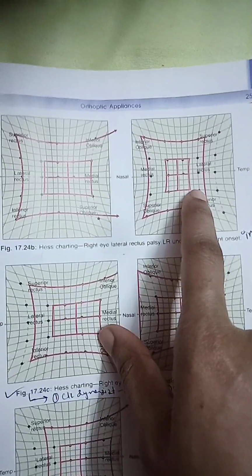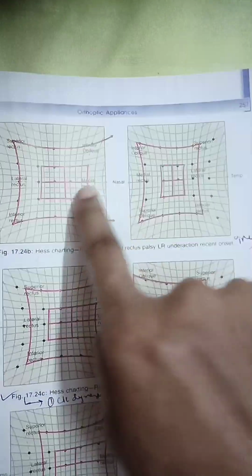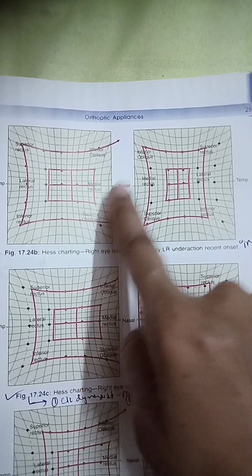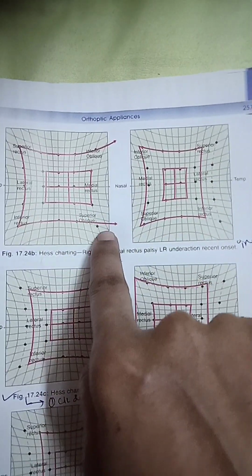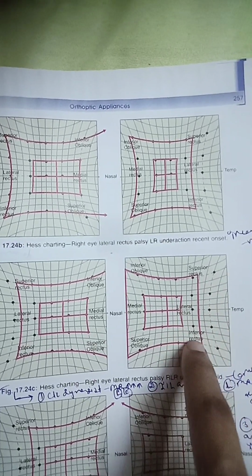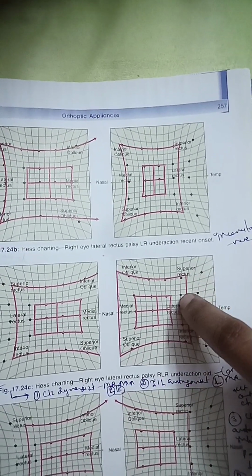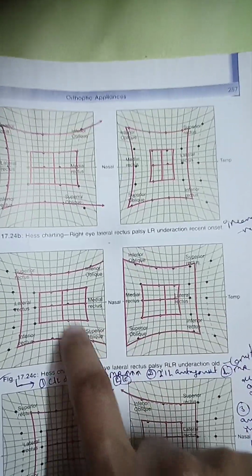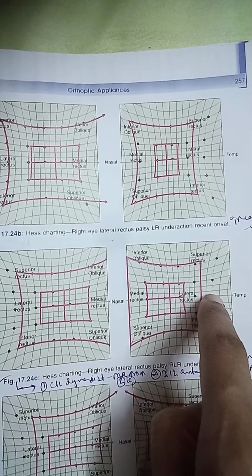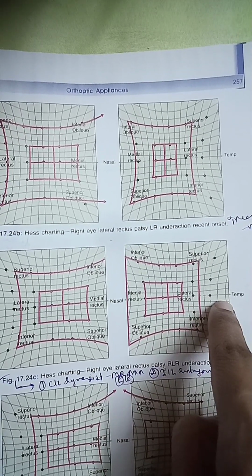See here, it is only the contralateral. Here there is a right lateral rectus palsy, and contralateral left medial rectus is overacting. Okay, everything else seems almost normal, but here you will see this muscle, right lateral rectus, is underacting. This is the normal field, it's underacting here. And it is overacting, it's going beyond this point. So this is underaction, right lateral rectus underaction.